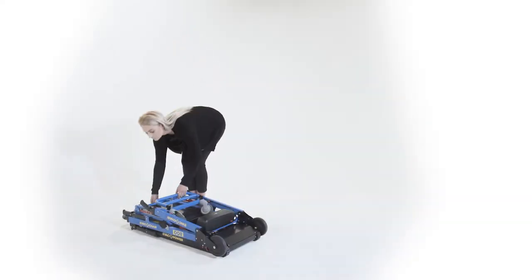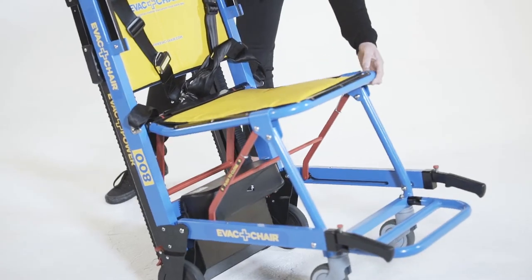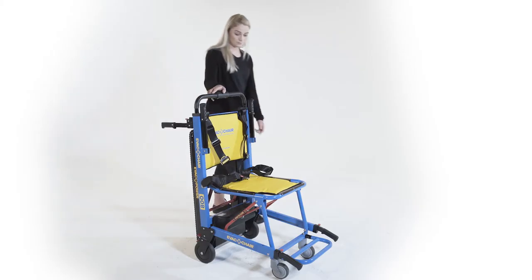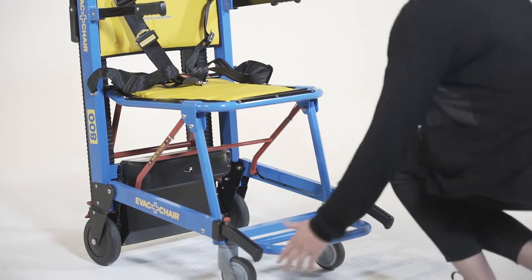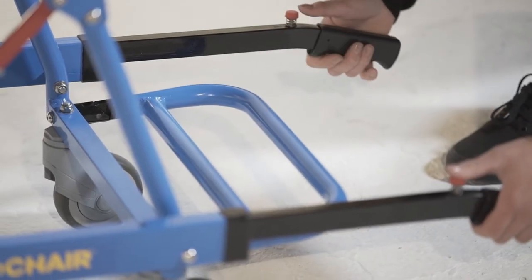Holding the chair by the handle, lower the seat into its horizontal position. Extend the handles on the back of the chair to assist with horizontal travel and the front of the chair to be used as armrests. For two-person operation, the front handles can be extended to aid in guiding the chair up or down the stairs.